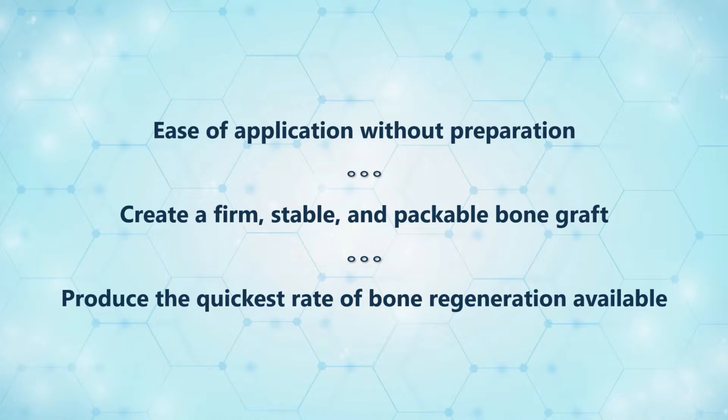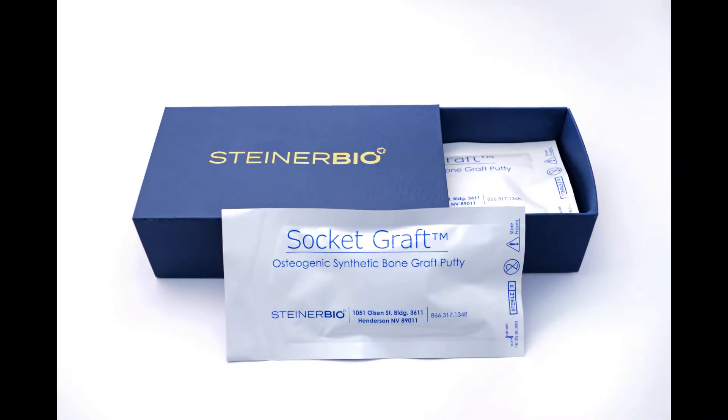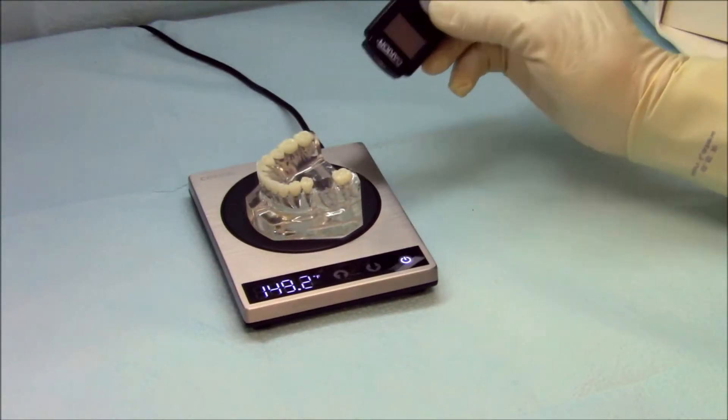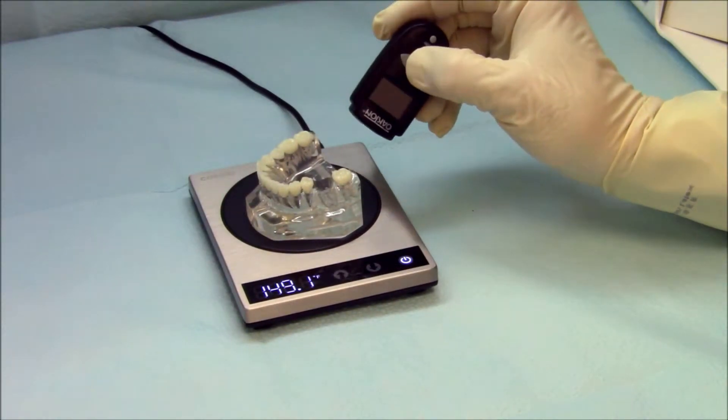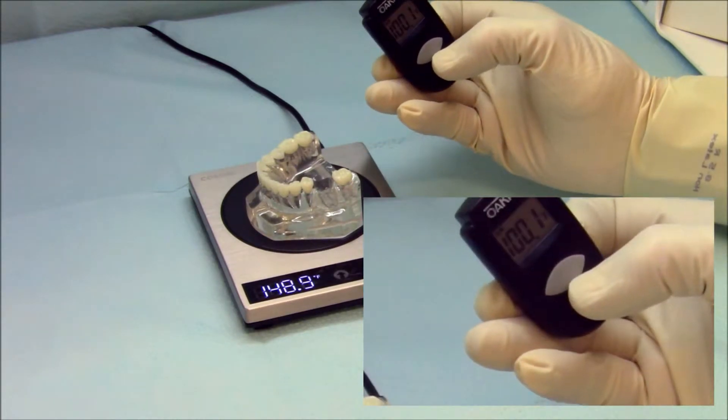The following is a practical demonstration of socket graft as it is applied to a model to show you the ease and speed of the process. Here we have a model that is heated to mimic the oral cavity. Throughout our development, we discovered that the graft material reduced inflammation and postoperative pain.